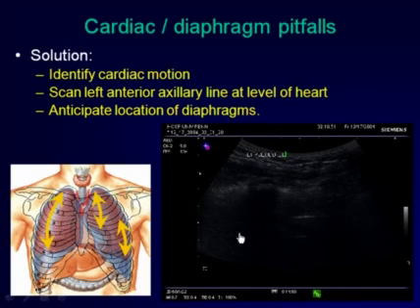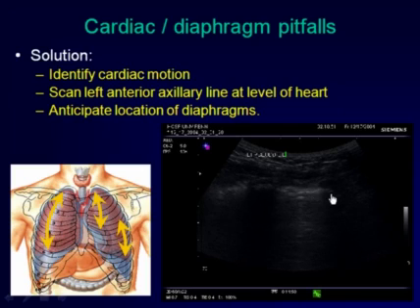And right here, we can see something that almost looks like a leading edge going forwards and backwards here, but careful examination of this image shows that when this piece of lung slides back, there is actually still an area here with the same beating motion, and this is obviously the heart. It's also interesting to see how the heart does create transmitted movement all along the pleura in the surrounding lung.